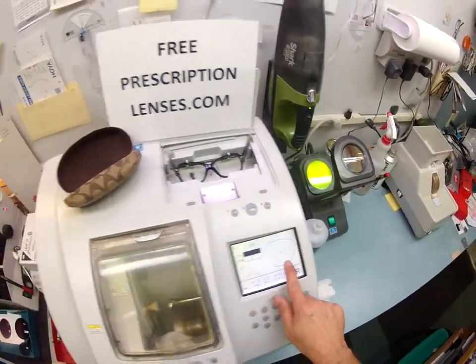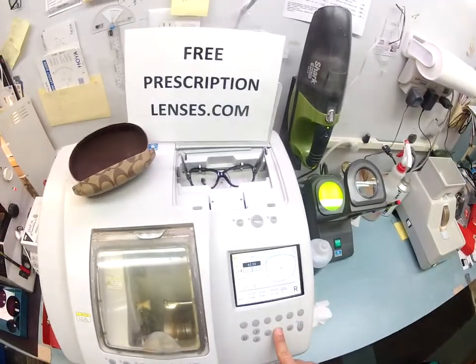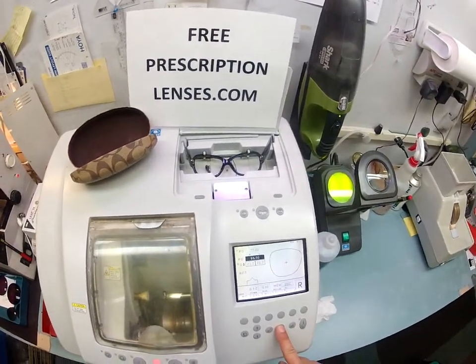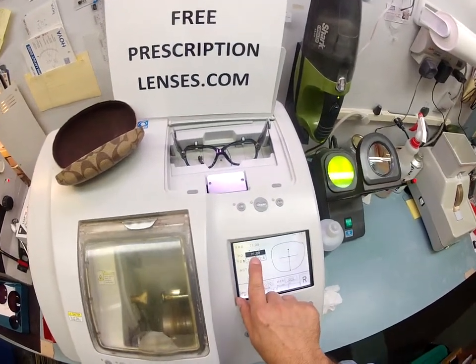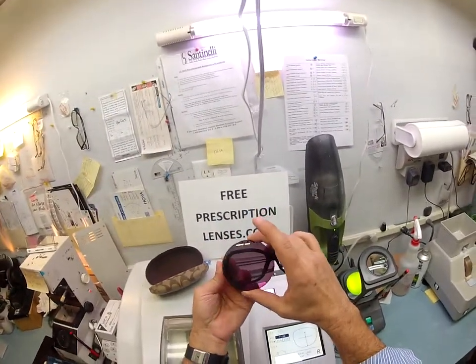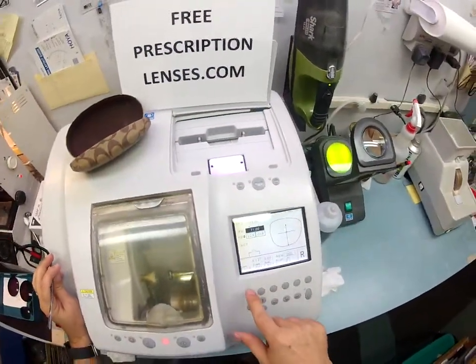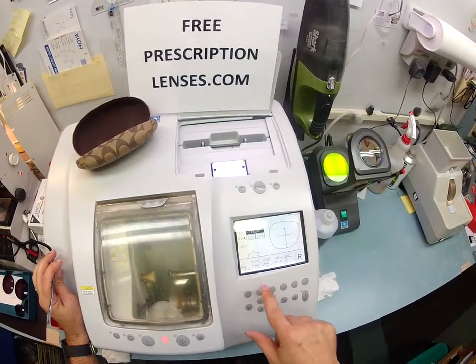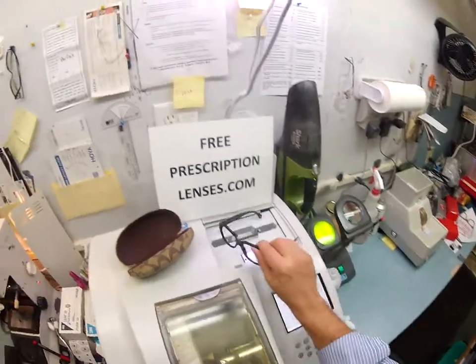So I'm going to pull the shape of your frame up. We're going to do this the old-fashioned way because it's a large pair. I'm going to decenter manually, and I'll show you how I do that. I'm going to have your PD match the frame PD. Normally, I would try and decenter your lens, but due to the size, I'm just going to do it manually. Let me put your lens down before I lose that. So this is a sunglass lens being cut for a plastic frame, which is an old-school name for zyl.